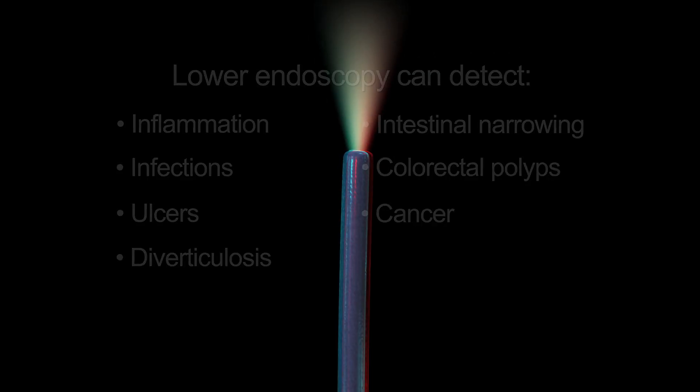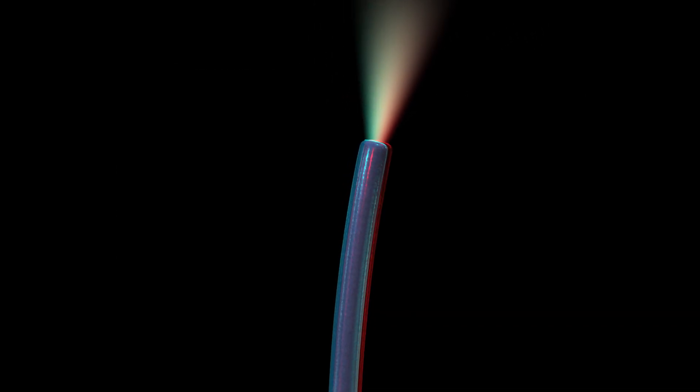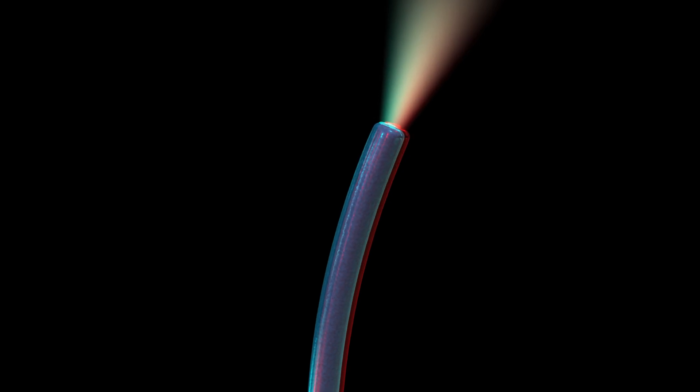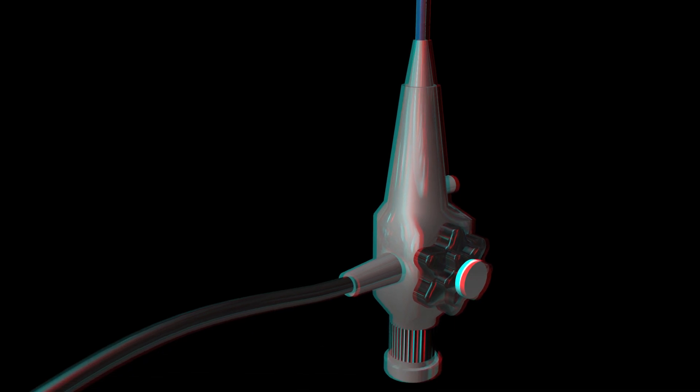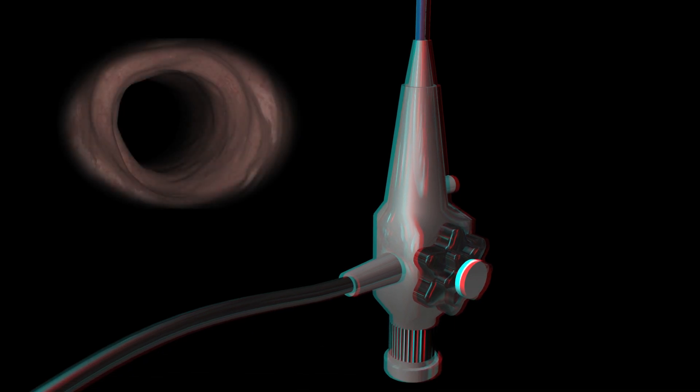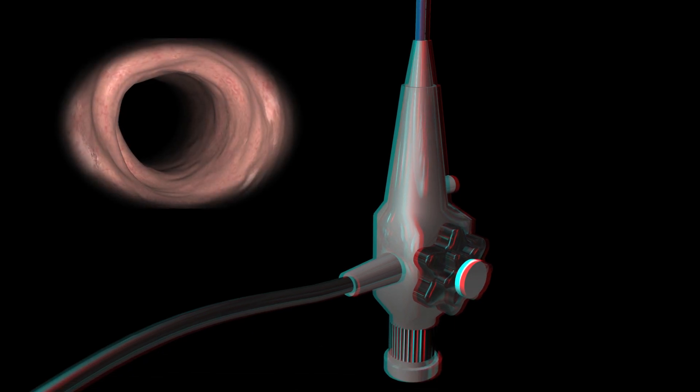The procedure is performed using an endoscope, which is a long, thin, flexible tube with a light and a tiny video camera attached to the end. The camera transmits an image to a monitor.